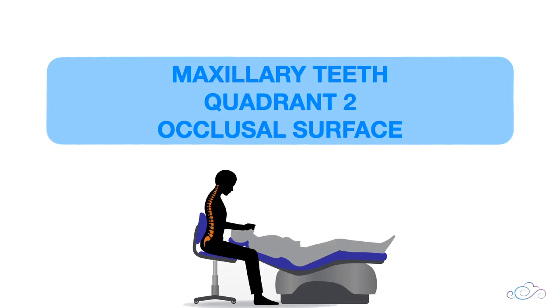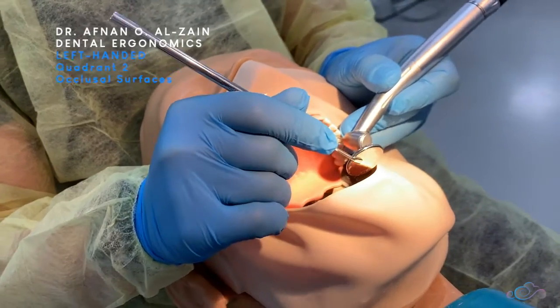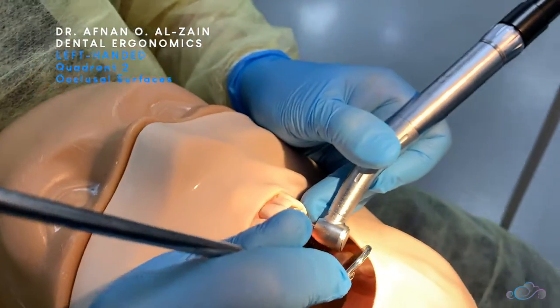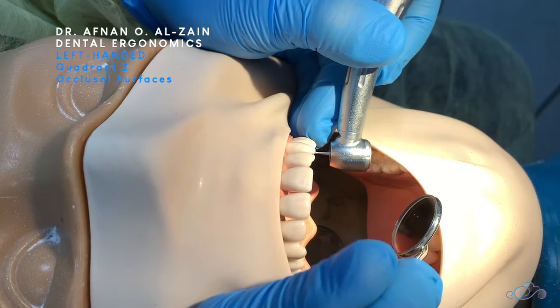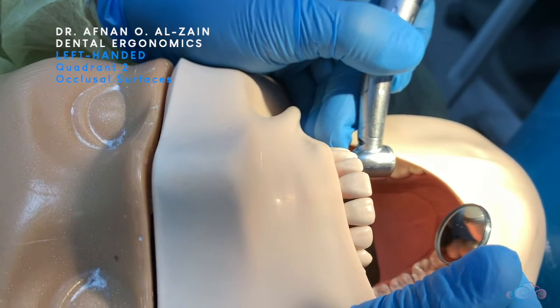Moving on to the occlusal surfaces of quadrant two. You're going to sit behind the patient, retract the soft tissue, place finger support on the teeth or alveolar bone, and then place the burr perpendicular to the surface. Place the mirror behind the handpiece and tilt it at an angle until you can see the occlusal surfaces clearly.